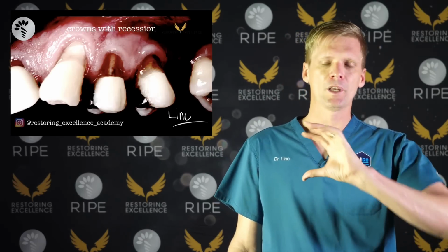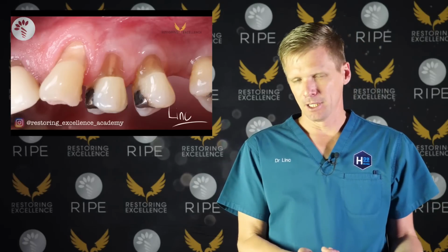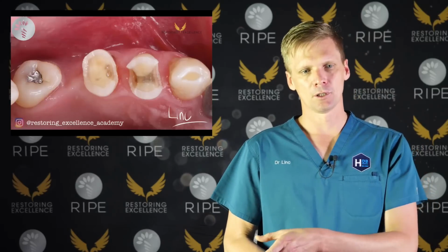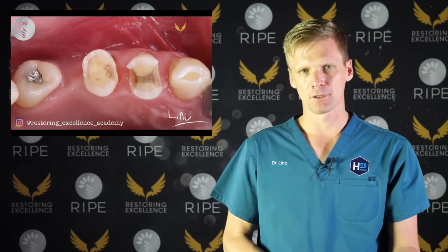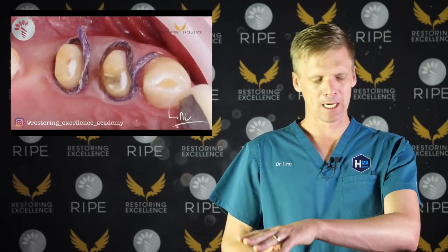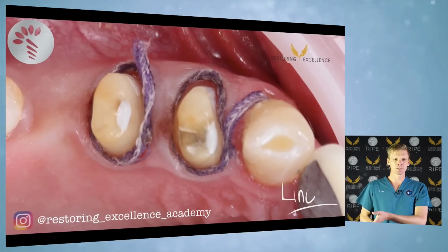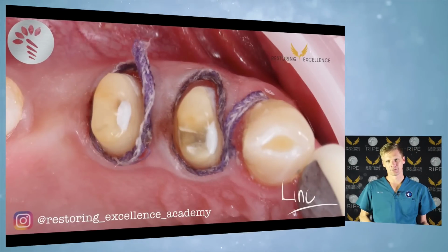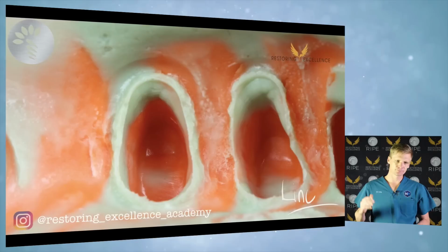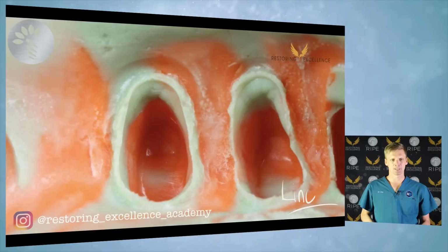When you have recession like this, a lot of it comes down to the core buildup. This case is easy from the occlusal, but from the buccal it's harder. Same steps, we do the reduction, we're going to do the core buildup. You can see we've done the big blob of composite core buildup, okay? And then we prep single cord with the 000 cord first, then the second cord with the 0 fat cord, and then we wait. Very important, we wait, and there we go. This impression came out first time. That big recession defect I had to fill in with the core buildup, otherwise I just have a great big undercut there.